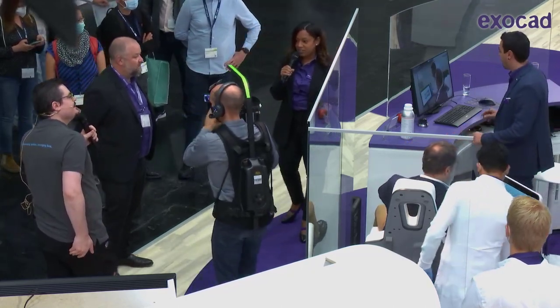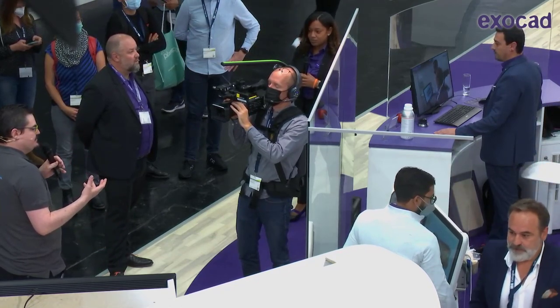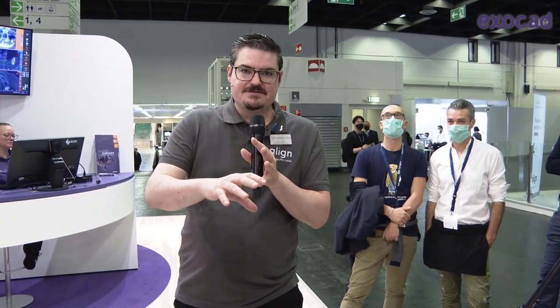There are two screens on the iTero scanner. On the lower left you always have the viewfinder, which enables you to find your way and see what the lens is actually seeing. In the middle of the screen is where the 3D model is being built up — that's your reference. You can always use that in case you miss a spot or lose track of the arch, so you can get back a centimeter or so.